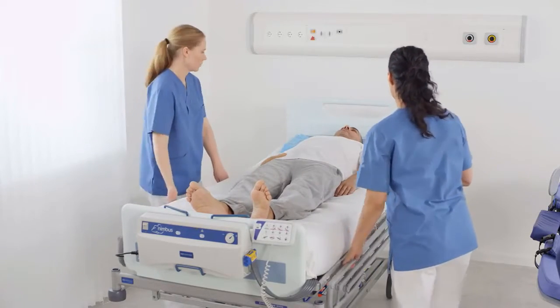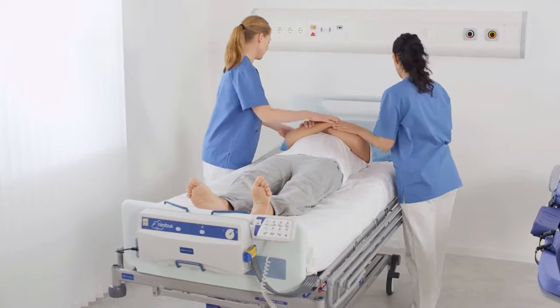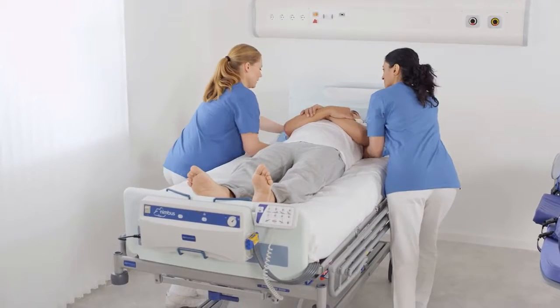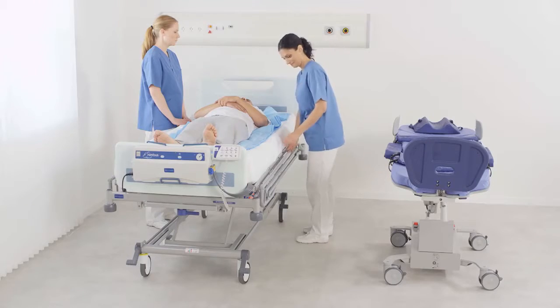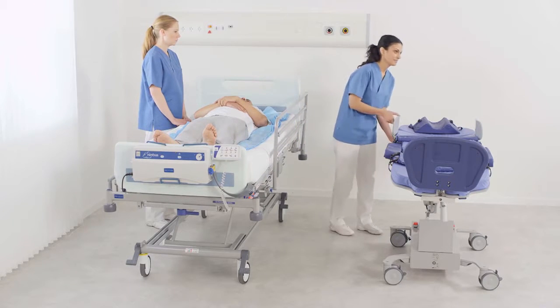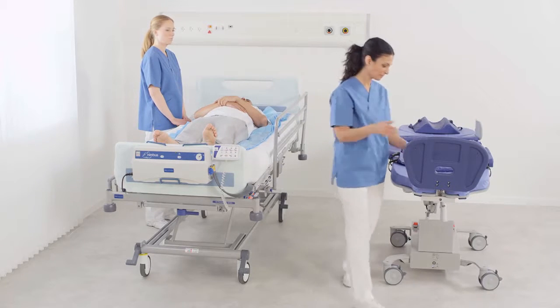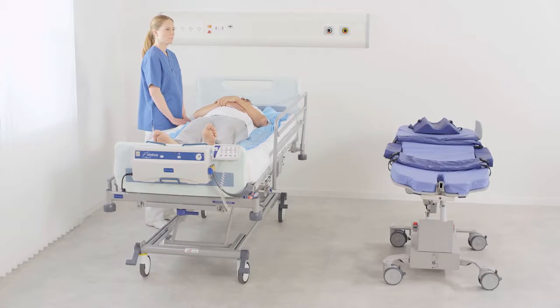Fold down the bed rails. Place the patient's arms in a secure position. Gently fold out the sliding sheet underneath the patient. Never leave the bedside without folding up the bed rails. On Sara Combilizer, pull out the spring lock and fold down the shoulder support. For a smooth transfer, keep enough space by adjusting or removing the foot support.